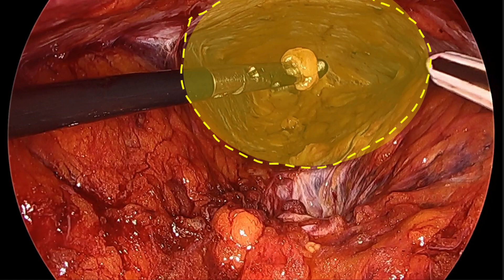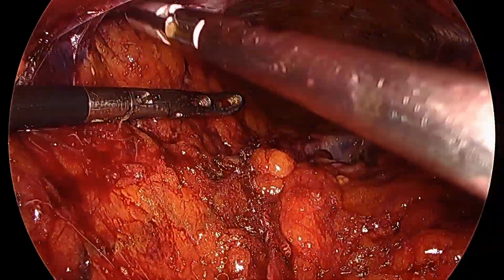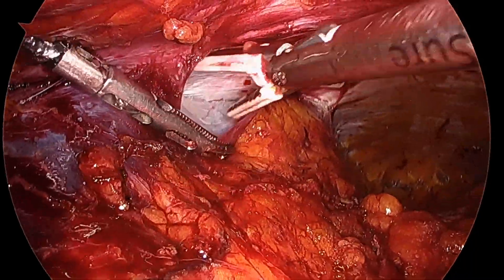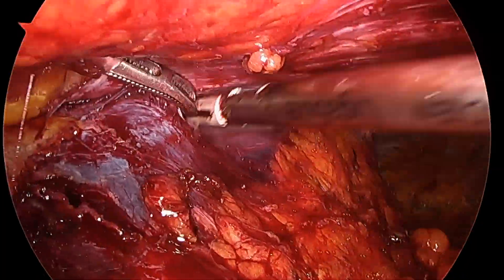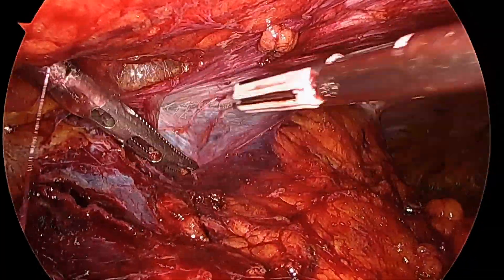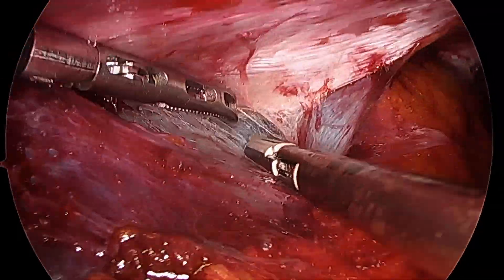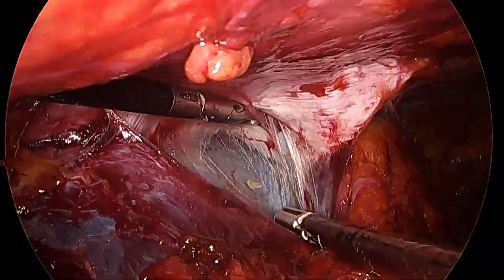You see there zone 2 of dissection. The next task will be to dissect what Miguel Ángel García Ureña and Javier López Monclus in the Madrid modification to TAR describe as the area of desert, which is where the peritoneum is very thin. To dissect this area, if we try to go from medial to lateral, we are most likely going to open the peritoneum because it's very thin.